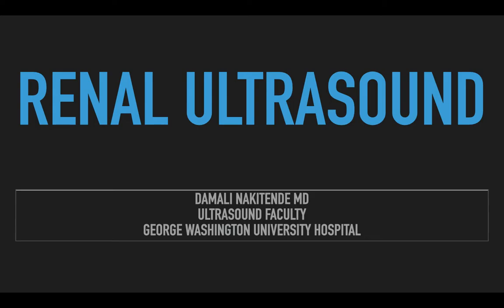I am one of the ultrasound faculty members at George Washington University Hospital, and today I'm going to be talking about renal ultrasound. So I love the kidneys. Hopefully after this talk you are able to love the kidneys just as much as I do, and we can teach you all about renal ultrasound.